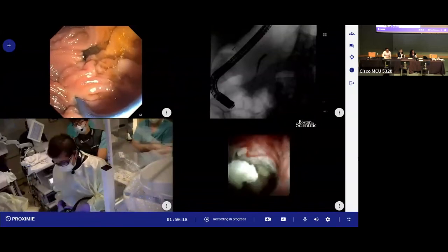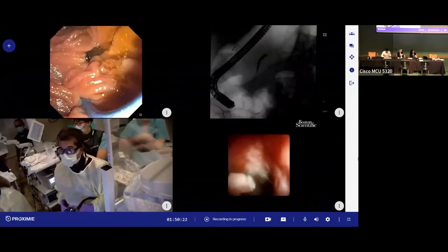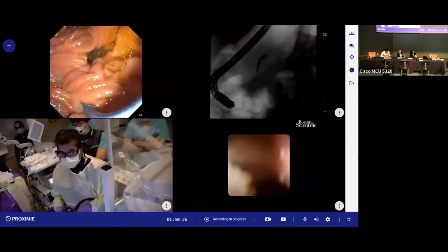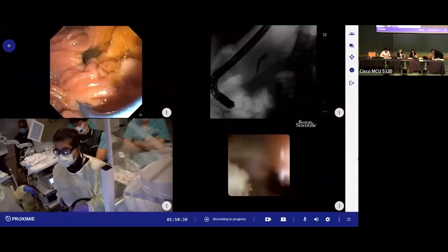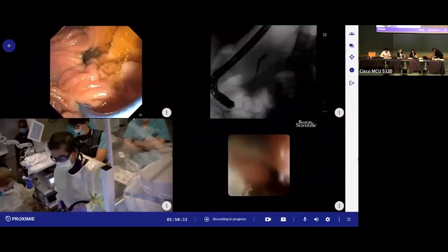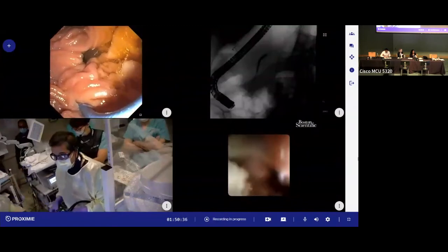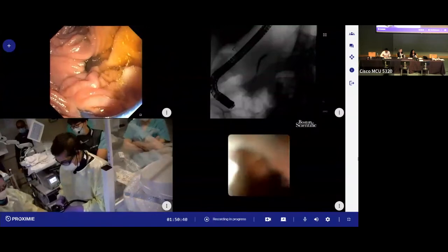And so we're going to just inject some contrast. If you want to stick around for the contrast to see the upstream duct, we can show you that, but it's entirely up to you, Sachin. Okay, Raj, we'll stick with you for 5 more minutes before Mihir's lecture. Okay, I think you're stuck on this. Okay, so, here's, okay. So go ahead and, yep.